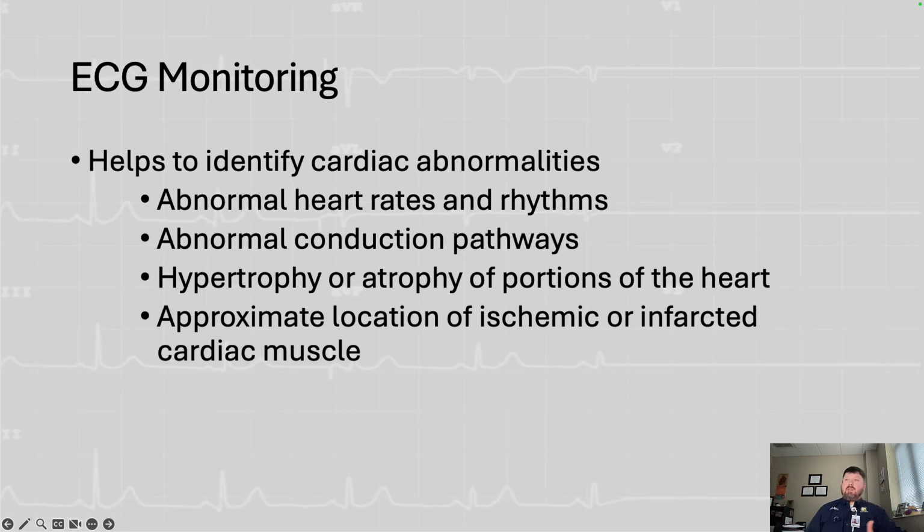So what can it do? Essentially, it helps you identify electrical cardiac abnormalities. Now, we know there's two functions of the heart. You've got your mechanical function and you've got your electrical function. And they both correlate together, but the ECG monitor itself is going to show you what's happening electrically within the heart. It can tell you abnormal heart rates and rhythms, abnormal conduction pathways.